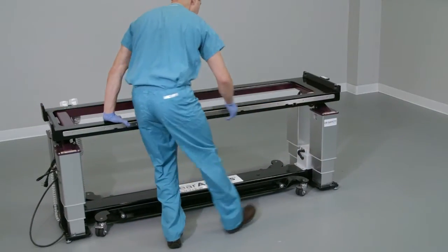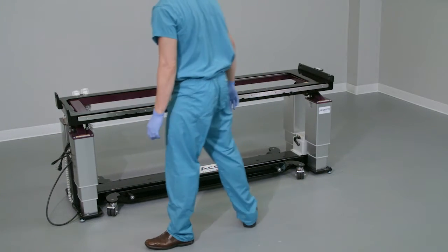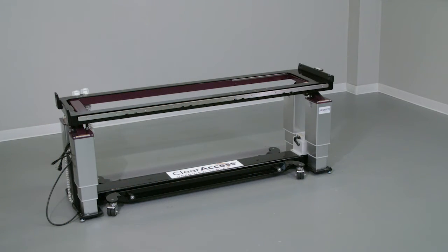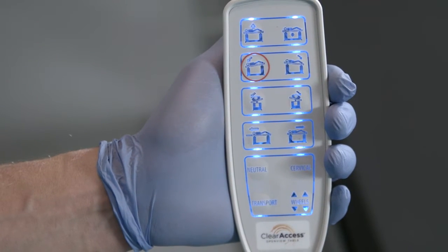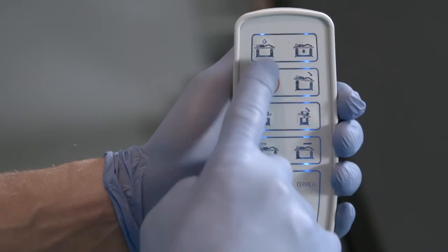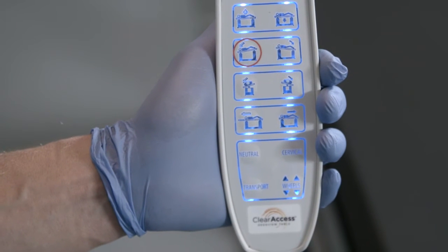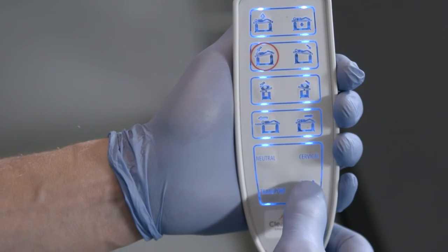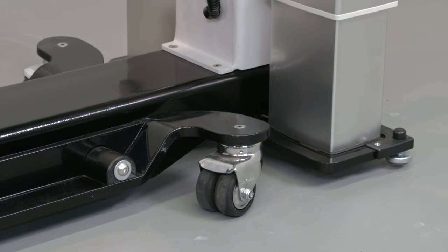Move the Clear Access Table to the preferred location in the OR. To lock the table to the floor, press any button on the hand controller to wake it. Both hand controllers will auto-sleep if inactive for 30 seconds. Press any button to reactivate, then lock the table by pressing the wheels button firmly once and releasing. You'll note an audible beep as the table is lowered to the ground, warning caregivers to keep personnel and equipment clear.